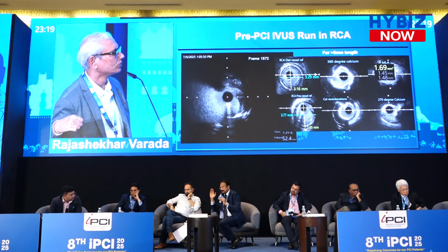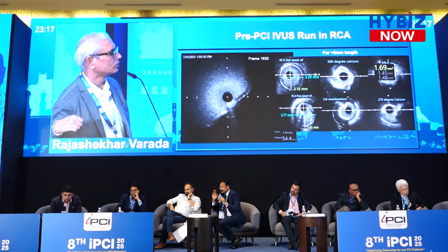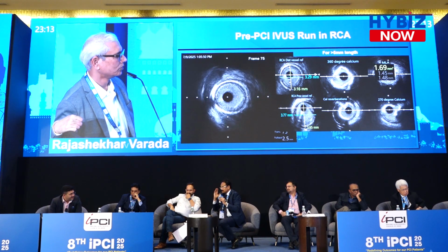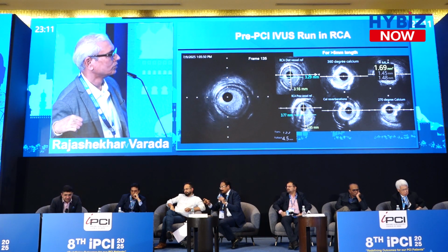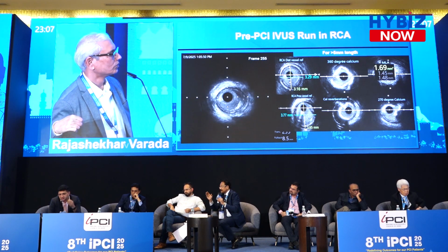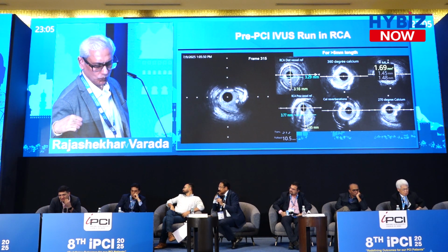I fully agree with Dr. Arun Mohanty that we may require something to crack the calcium. So it is not atherectomy alone. We have to crack the calcium for full device expansion. So cracking may require either IVL or OPN. It depends upon the pocket strength of the patient also.